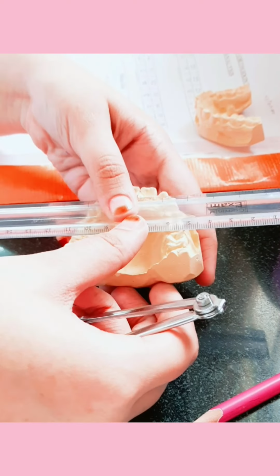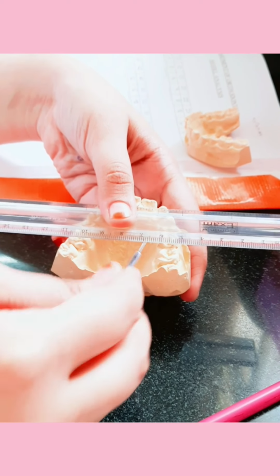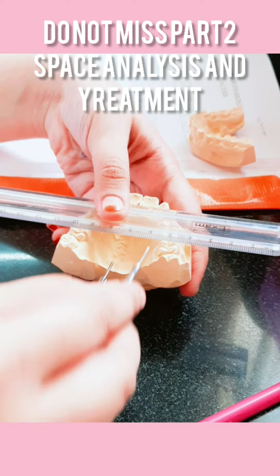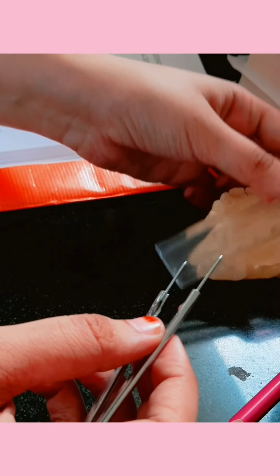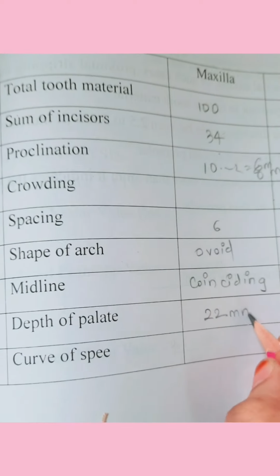Now we measure the depth of the palate. All you have to do is keep the scale on the occlusal plane, and then with the help of divider, again from the deepest part of the palate till the scale, we take the measurements with the help of divider. So the depth of palate comes to 22 mm.